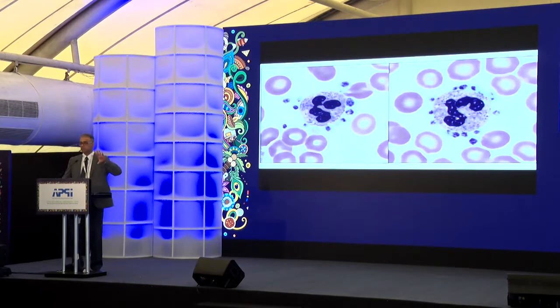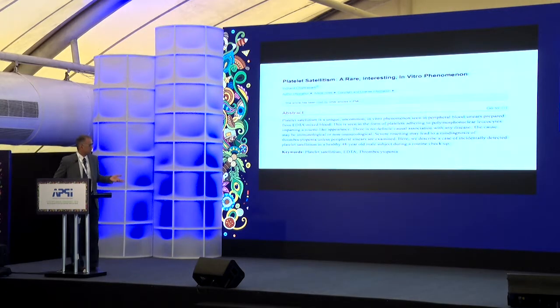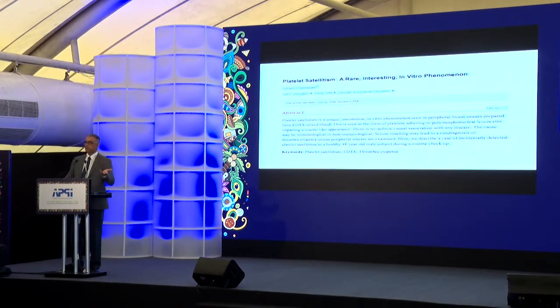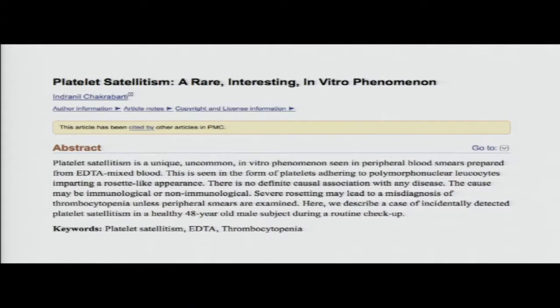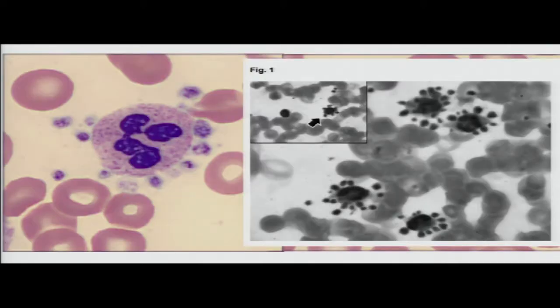Nice platelets around the granulocytes — platelet satellitism. Again, this would have been seen under the microscope. That's from the paper and this is from the image we took from our slide, with colleagues Dr. Preeti and Dr. Pradeep who contributed to this case.